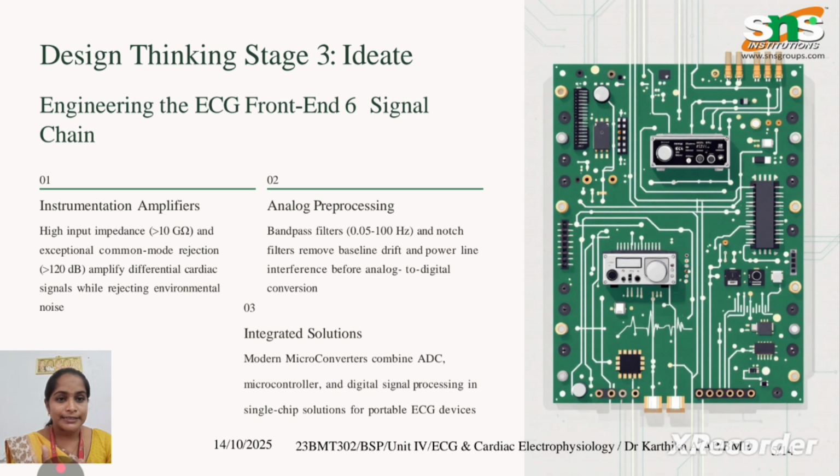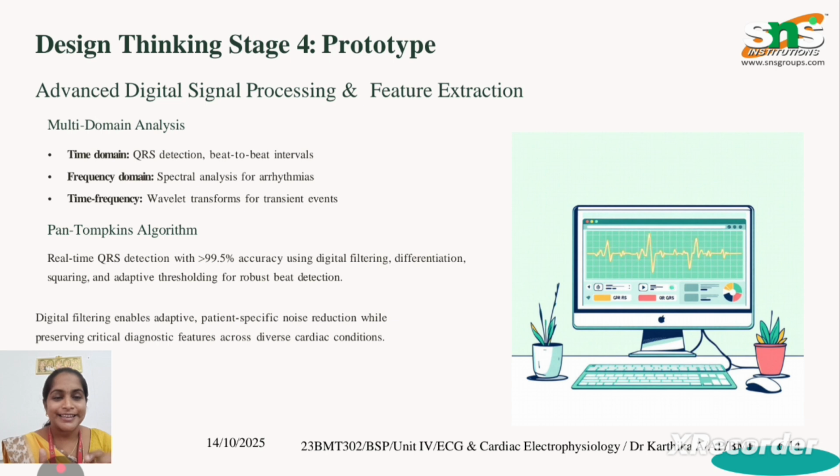And the integrated solutions involve modern microconverters that combine ADC, microcontroller, and digital signal processing in single chip solutions for portable ECG devices. See here in this prototype part we have multi-domain analysis: time domain, frequency domain, and time frequency. In the time domain we have QRS detection and beat to beat intervals, in the frequency domain we have spectral analysis for arrhythmias, and in time frequency we have wavelet transforms for transient events.